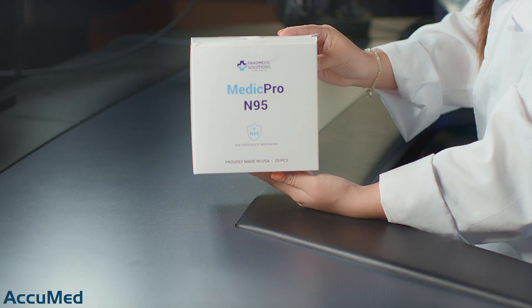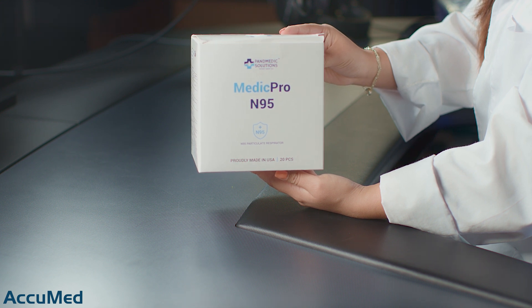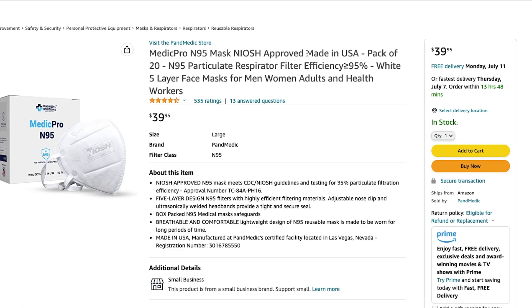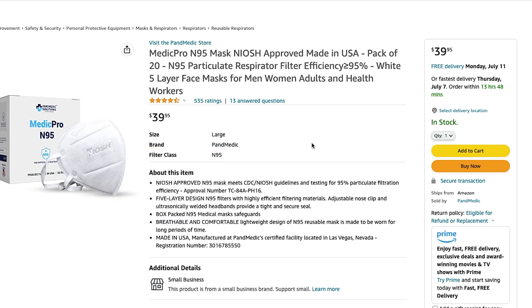Hello everyone and welcome back to the Acumet channel. Today we're going to be reviewing the Medic Pro N95 respirator by the brand Pant Medic Solutions. As you can see from the listing, these are N95 made in the USA. The box comes with 20 respirators for $39.95, and it also has a 4.3 out of 5 rating.